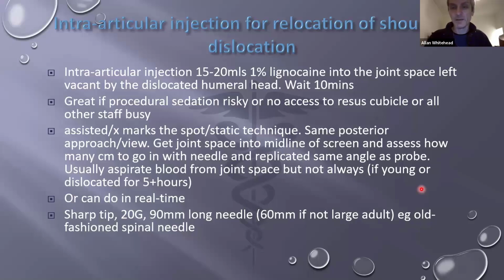Or it might be that you have access to a cubicle, but all your nursing staff and medical staff are fully occupied with one or more very sick patients, usually in the resus area. So they just don't have time to dedicate the staff that you need for the procedural sedation at the time that you want to do it, and it causes delay. So again, this gives you the flexibility to be able to do it outside your resuscitation cubicle area.